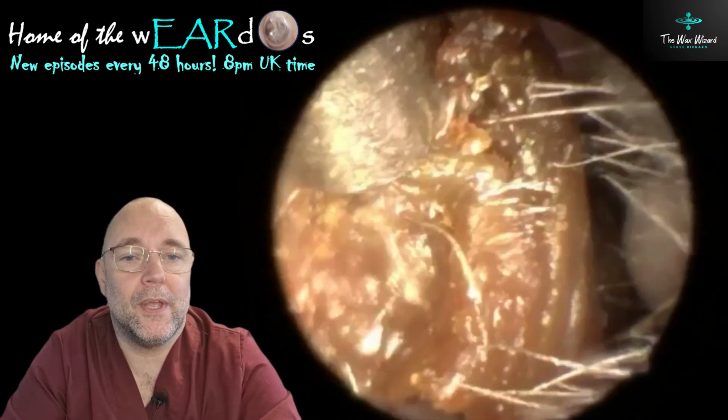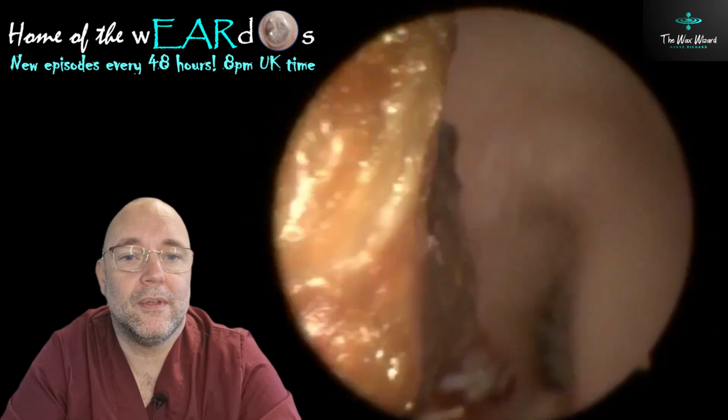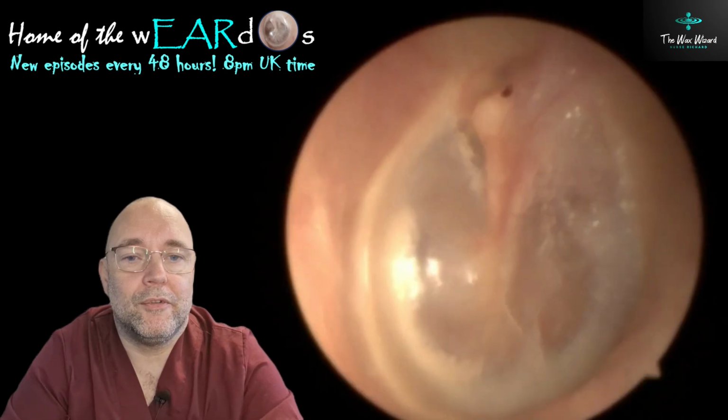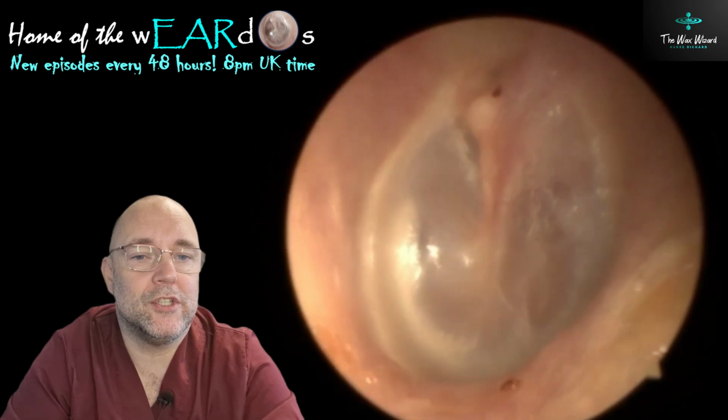I think this is the bit that made the difference to her. There we go. Fairly decent chunk, that. And what we've got left there, bit of scarring on the eardrum. Nothing too major, but she noticed a big difference anyway.